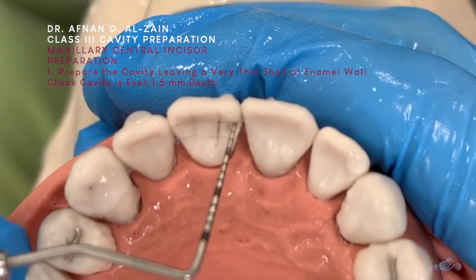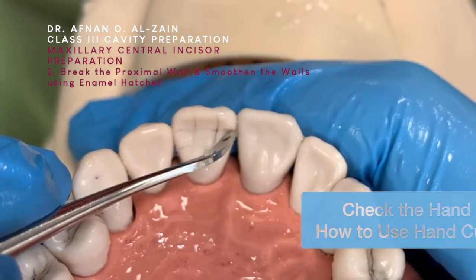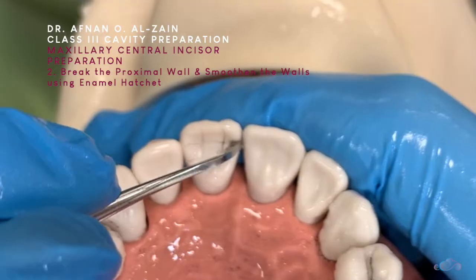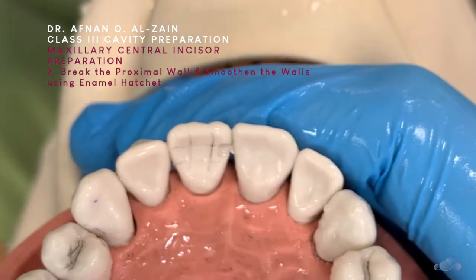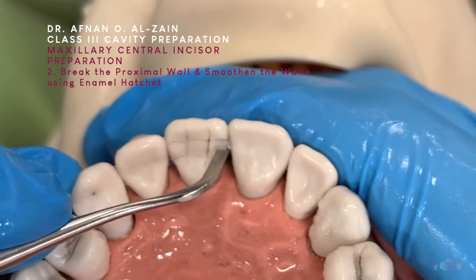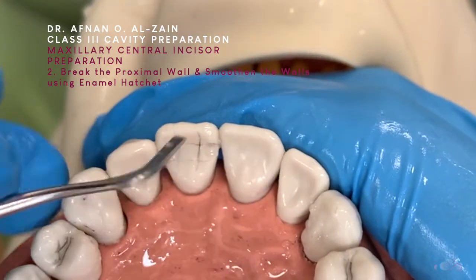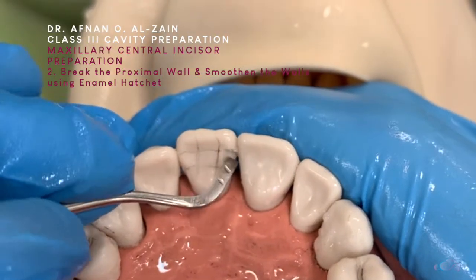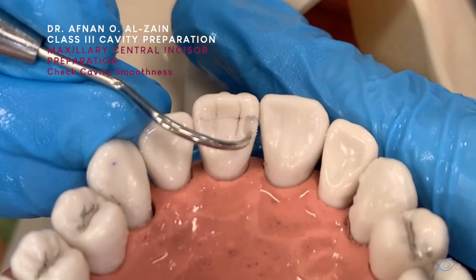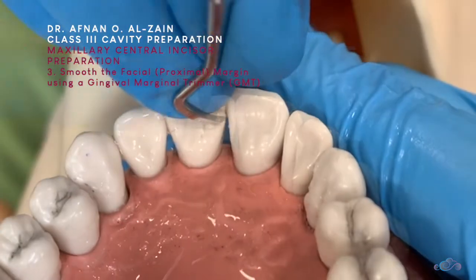Make sure all the floor is smooth, everything at the same level, against the wall. And then we're going to do a chopping action. We're going to go to the other side. We're just going to check that everything is smooth and roll along the facial margin or the proximal margin.